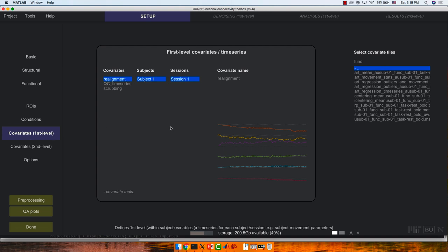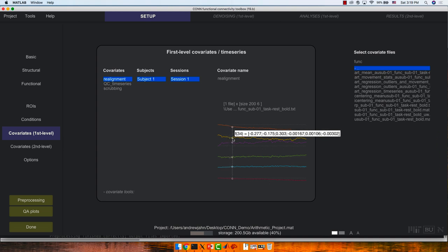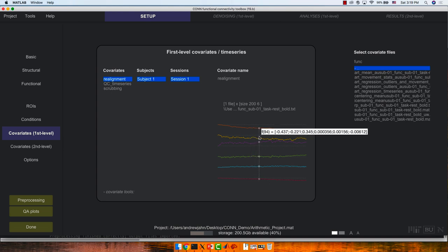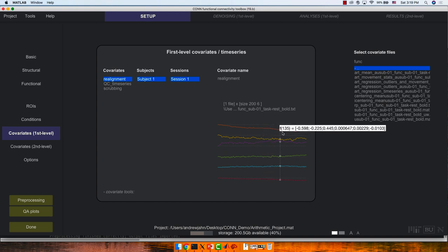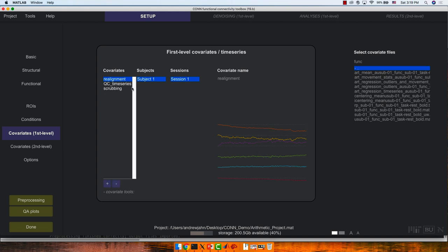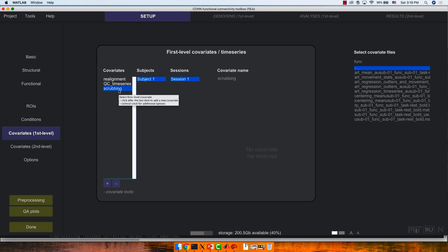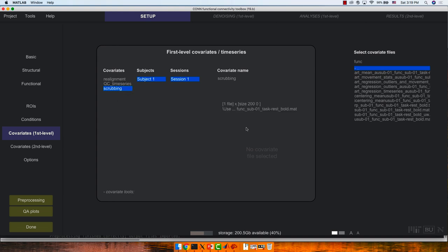Covariates first-level is the last thing to look at here. These motion parameters — the six realignment parameters — will show six numbers in a vector as you scroll along, indicating how much in millimeters the brain deviates on X, Y, Z and also the roll, pitch, and yaw. From this alone it can be difficult to determine whether there's a real problem. If you go to Scrubbing, you'll notice that no volumes pass that threshold we specified earlier. When we analyze all subjects, some subjects will have certain volumes scrubbed and they'll appear in that window.